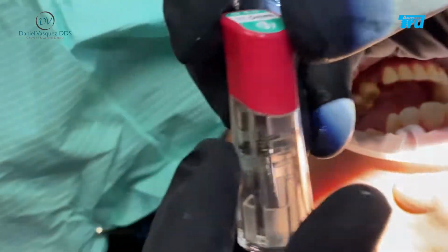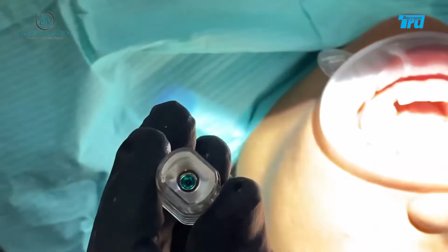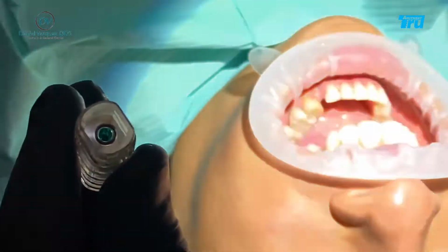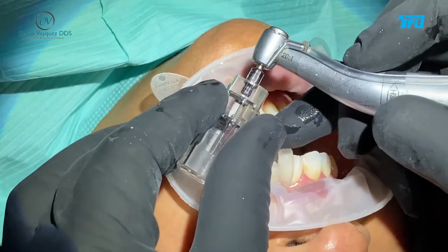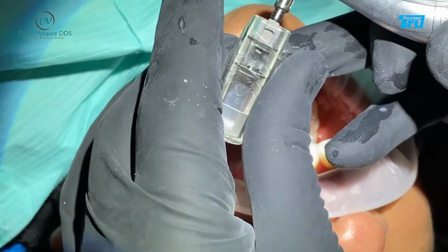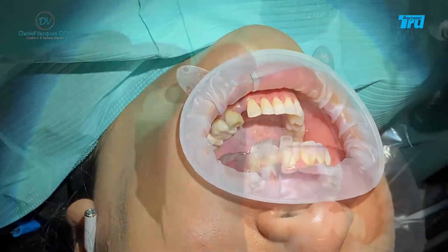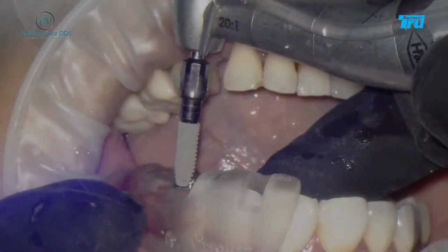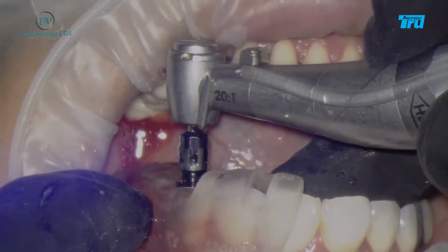Okay, perfect. So this is our implant. So we're gonna open it. It's right there. So we're just gonna load it, put the surgical guide back in, and we're gonna place the implant. So this is our implant. So we're gonna load it. Okay, beautiful. And we're going to change the RPMs. We're gonna take off the water.